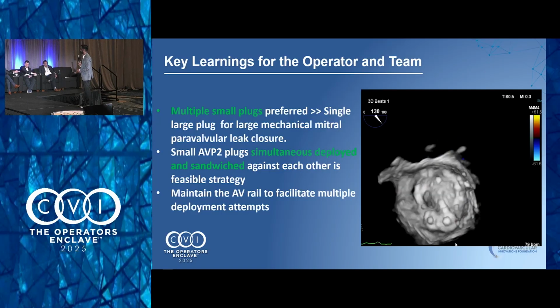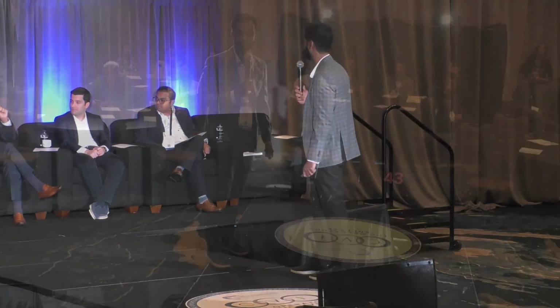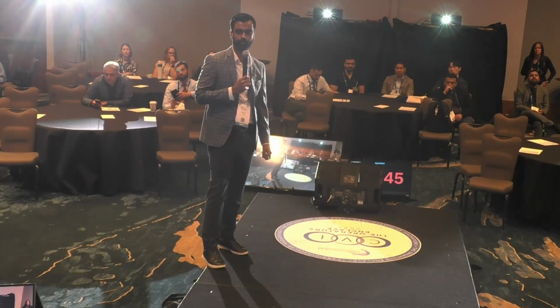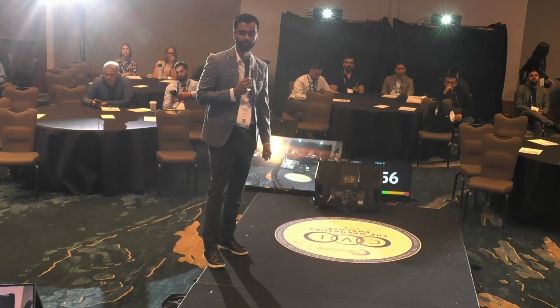So her hemolysis, what happened? Hemolysis stopped actually. She resolved, hasn't been transfused. It's been about 6 months, and she feels very good. I think one of the things about these mechanical valves is the hinge point is where you can put a bigger plug, and as you go around the hinge point, that's where the interaction happens. Usually a 12 will work where it's exactly closing right in the center, but as you go around the curve, you have to go to 8 or 10s because that's when the leaflets, and I think that's what happened with the 18. It's too big, but great result.